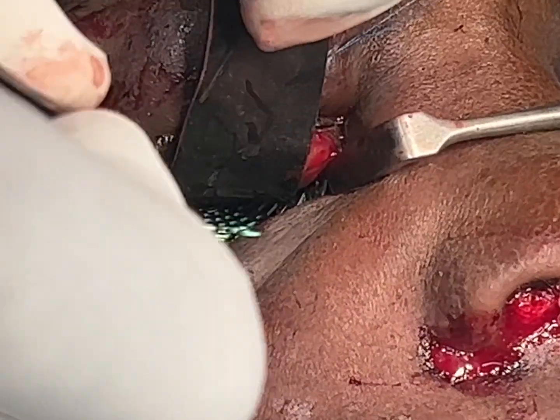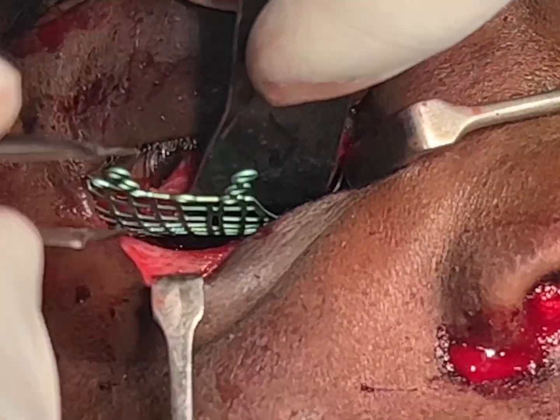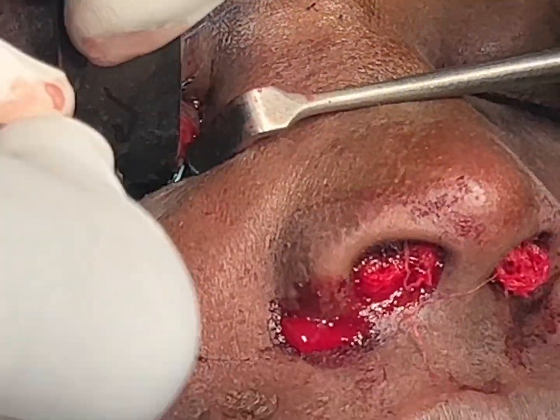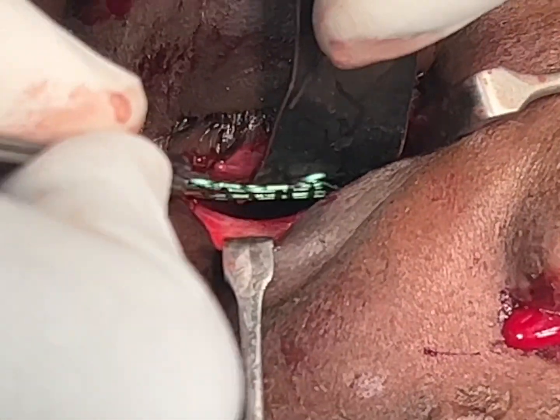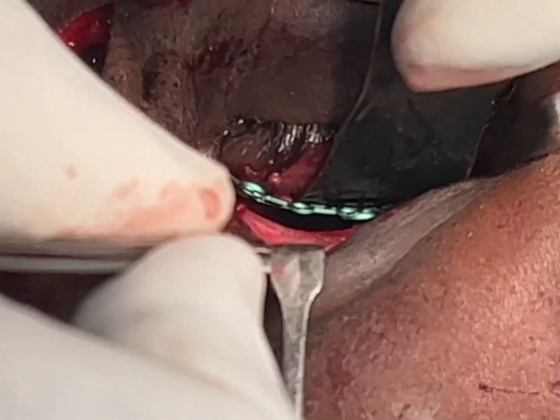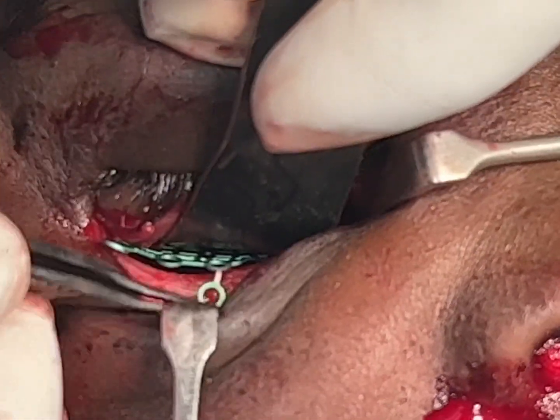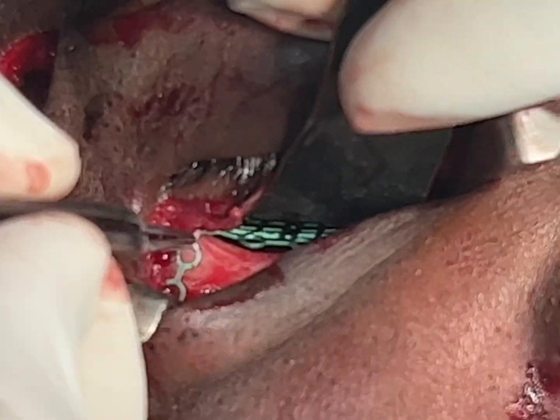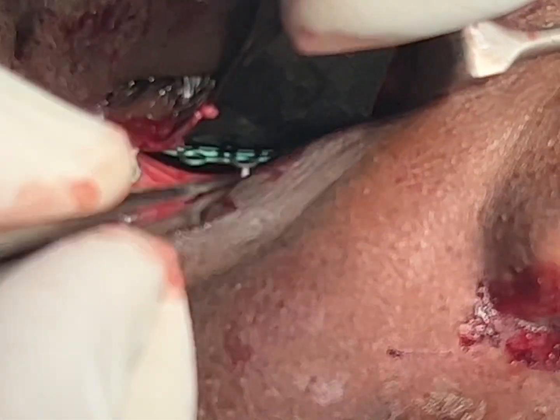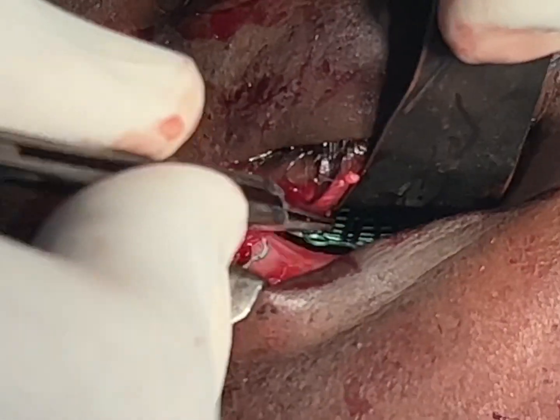We've done the dissection, removed the fat that had gone into the sinus, and I'm now gently placing this inside. Once it goes adequately inside — as it's done now — we just have to bend these plates down. It's very easy to bend these plates, and we put one screw each.